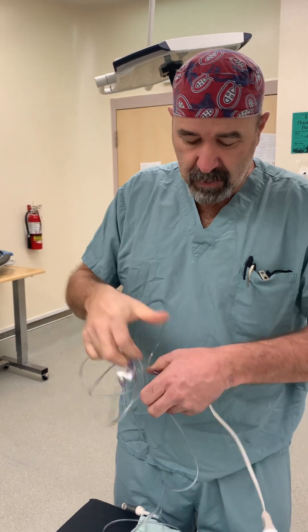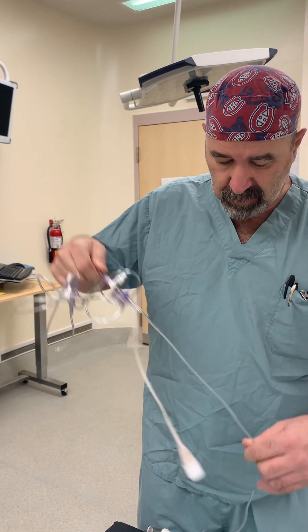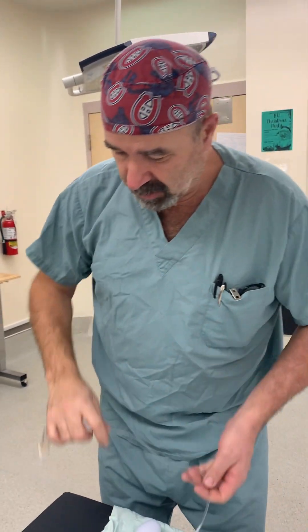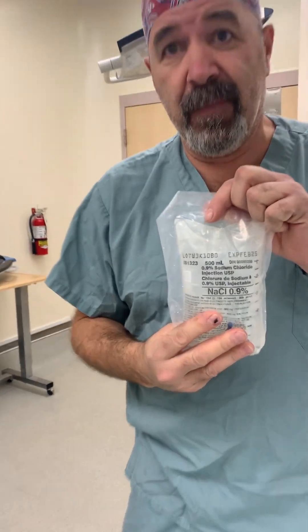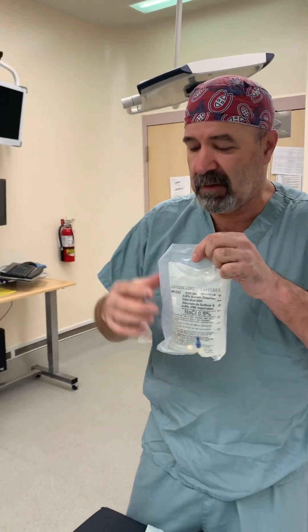I'm going to check this side here, make sure that's nice and tight. This line is ready to be attached to the 500 cc's normal saline. We used to use heparinized solution, but it was decided it wasn't necessary.